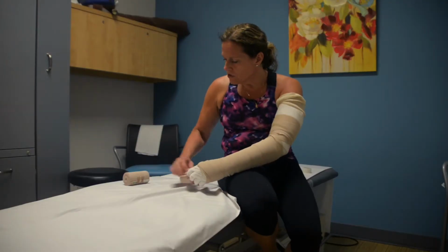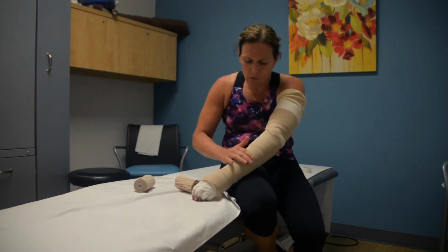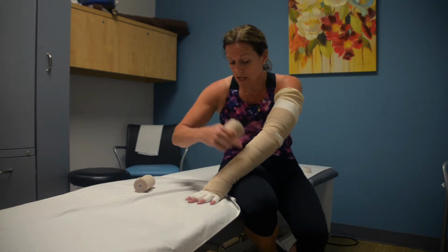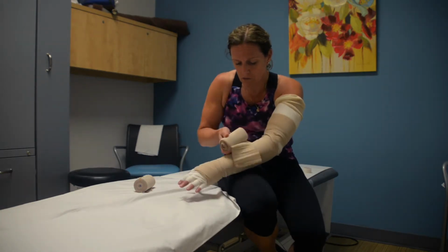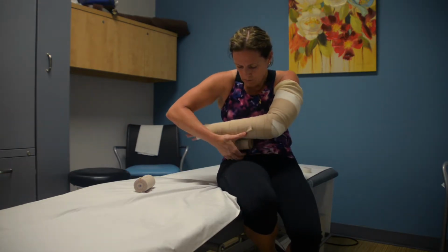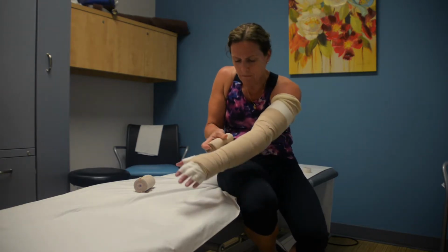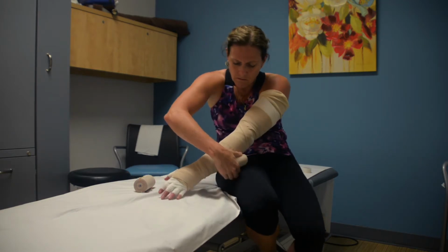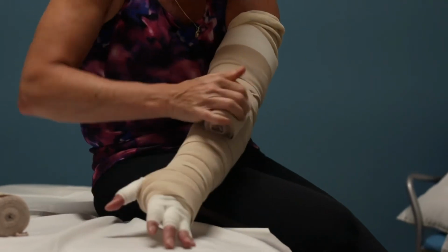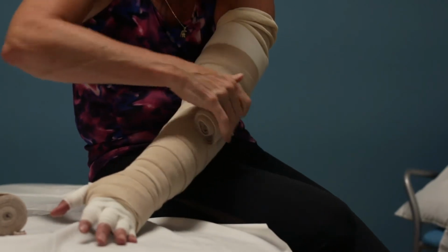So your third bandage starts right where your first bandage started, which is really above the wrist. So that's where we're going to start the next bandage. We're going to reverse that bandage. And we're going to spiral this up to the armpit. Keeping a little bit of tension on the bandage the whole time you're bandaging.